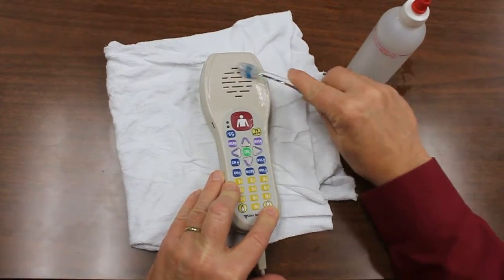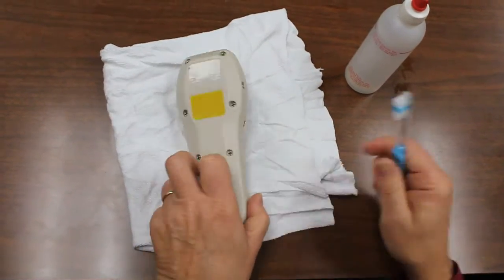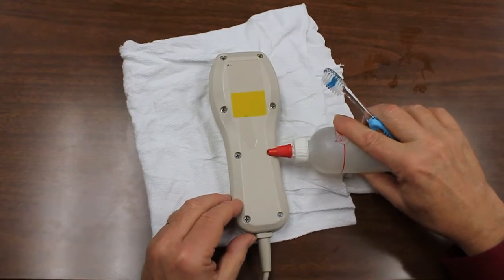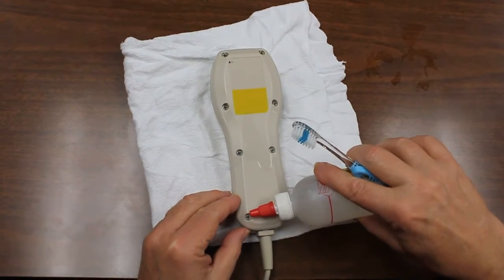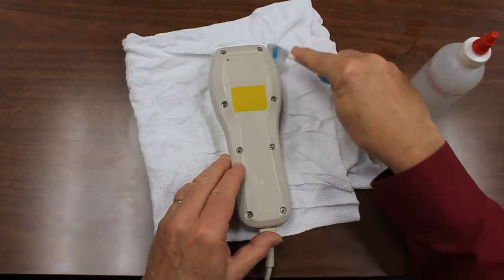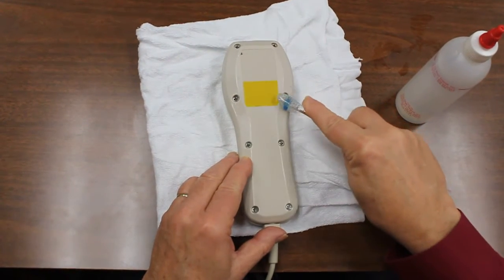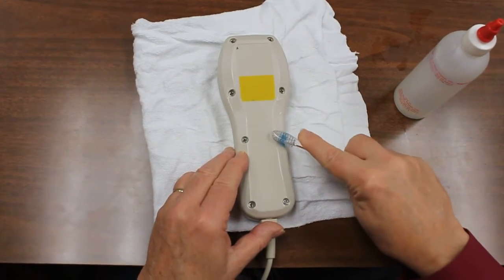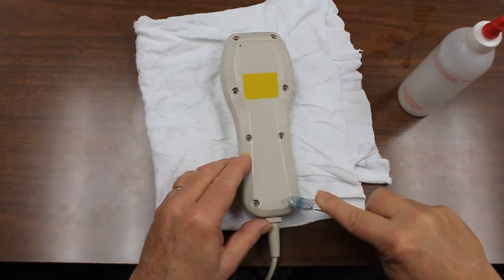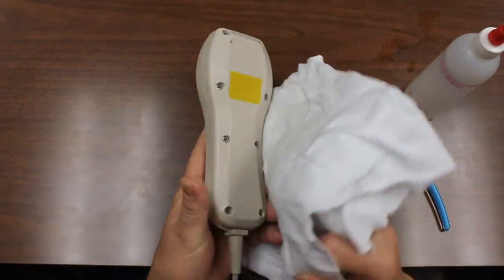Again, the alcohol will dry clean and not leave a residue. You can also do the very same thing for the screw holes — just putting some alcohol in those areas and then using the brush to clean all of the holes, making sure that there's no debris or contamination of any type. Then you can wipe the unit dry with your clean cloth.